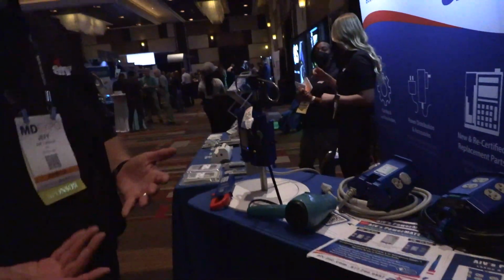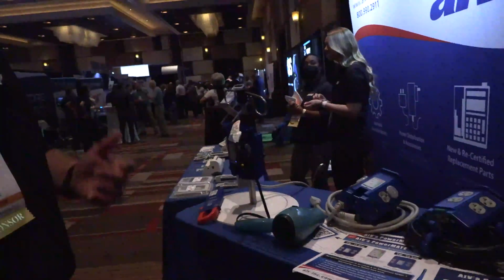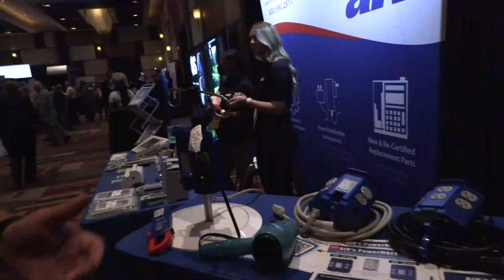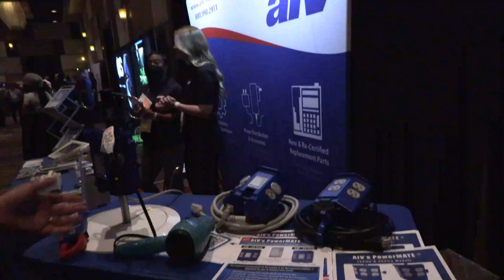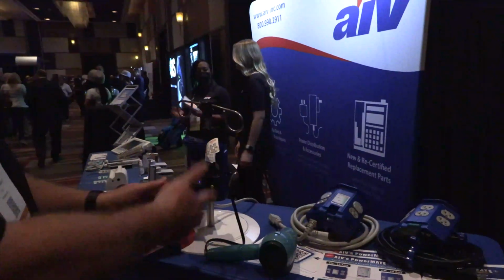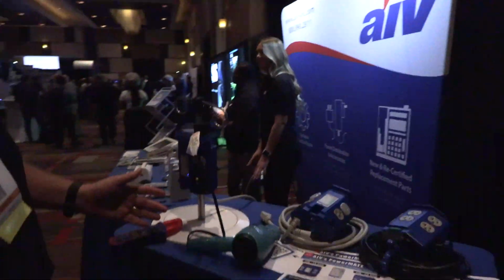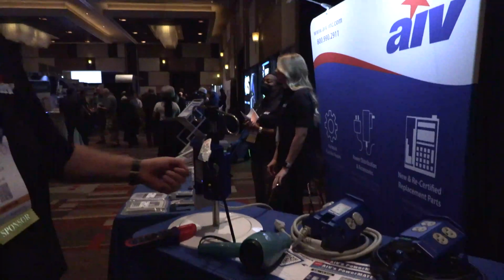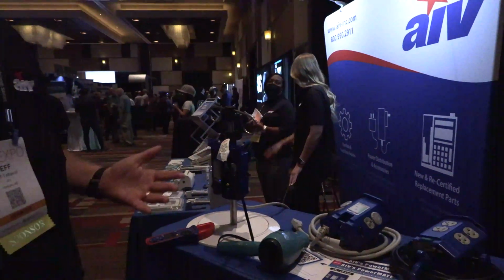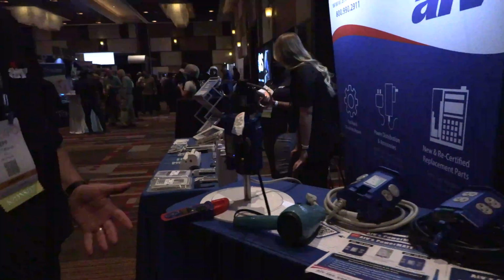We don't determine what PM should be on products; we allow the hospitals to do that. But one of the things would be, how do we check it? How do we validate it? You have a current meter, and it doesn't have to be a specific current meter. Get any current meter, hook into the current bar, track it, and compare it against the actual draw you're putting into it as a load. You can do your pull tests on there, your breaker tests, a breaker pop. So now you can come up with your own procedures on there. Ways to do it.